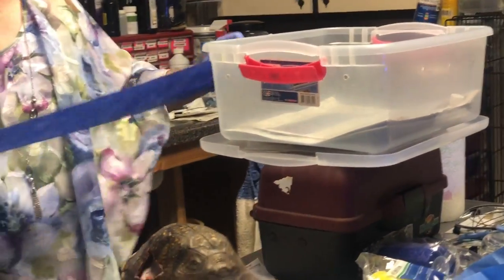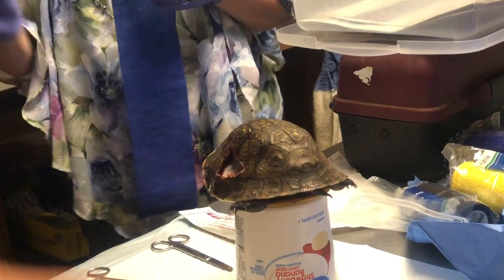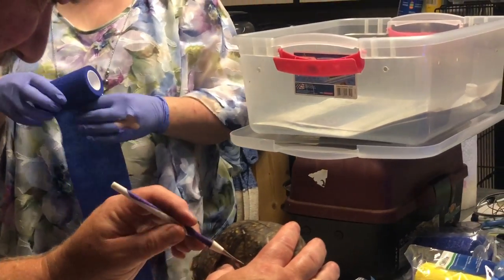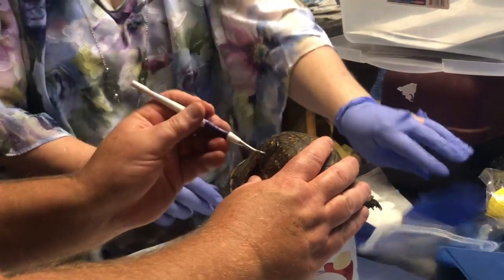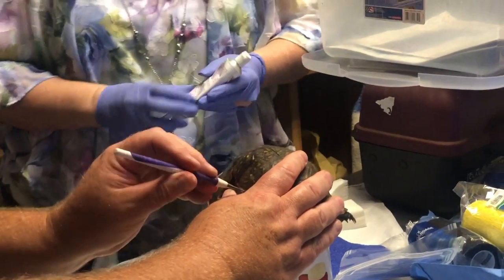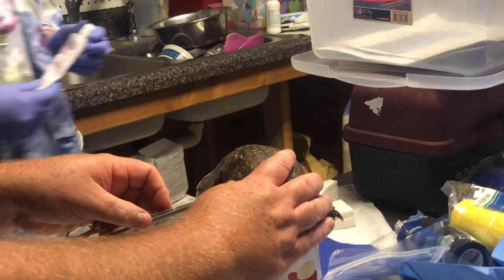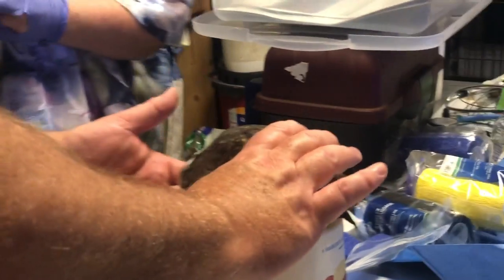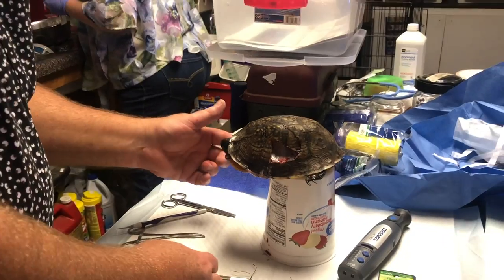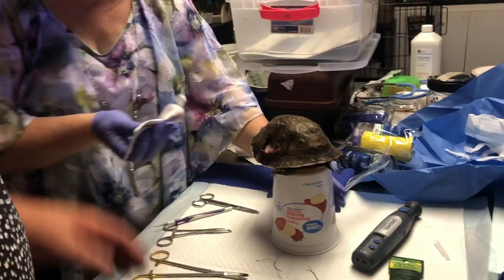I didn't bring my other stuff from the car. What are we looking for? Maybe a pick — let's get this reduced a little bit more. I don't know that I have a pick. Yes I do — if you see me use it, grab one. Perfect. Pop that in place. That's one thing I don't like to hear. All right, we're ready to dress — we're stable. Sorry about the piercings — you'll be sexy later. The stories you will tell: the humans picked you up and put holes in you.